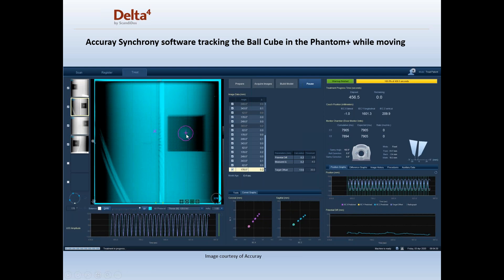The circle with the plus sign is actually the tumor they're going to be tracking. What they have going on their screen is where they are tracking the phase motion of the tumor with the phase of the breathing. They will account for that in their treatment so that they're able to track the tumor along with the motion being provided by the HexaMotion system.